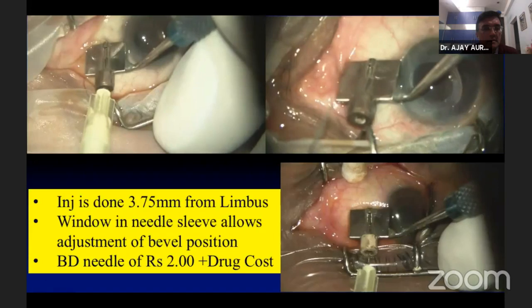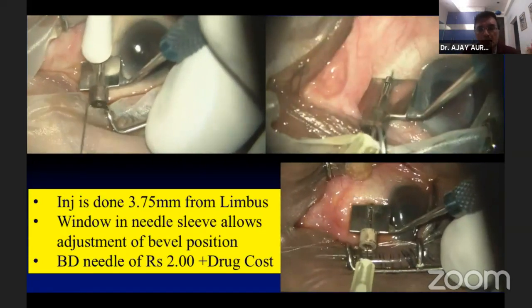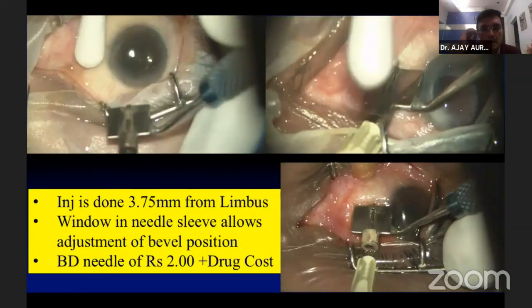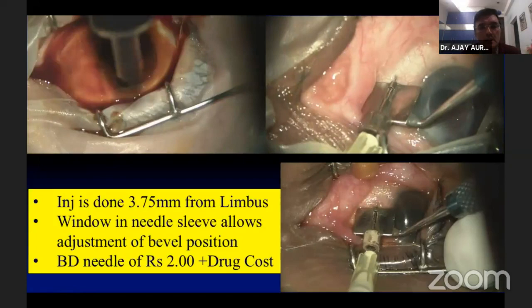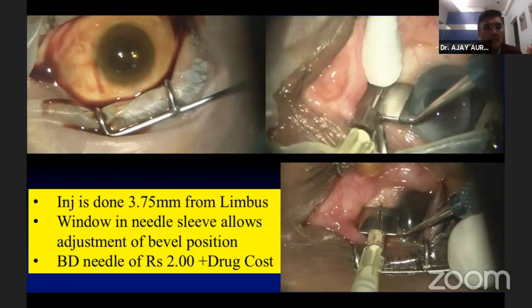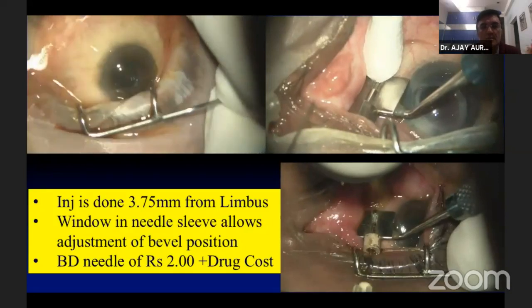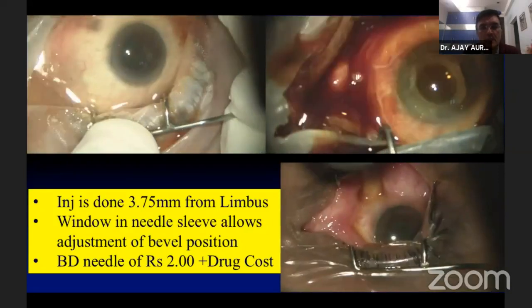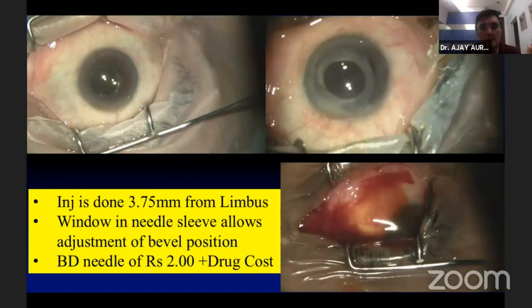The injection happens very neatly. There is not much problem, but yes, there is a little learning curve, and if you don't do it carefully, you will definitely become intravitreal. That's the worst complication that can happen, that the drug becomes intravitreal. But otherwise, most of the time you are able to succeed. In these 82 eyes, we've had 4 situations where it became intravitreal.